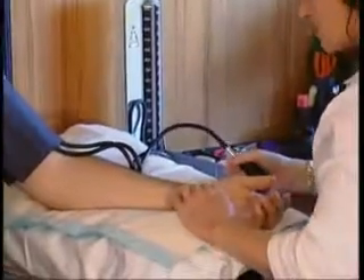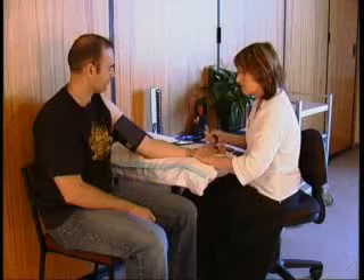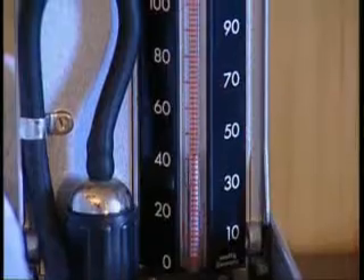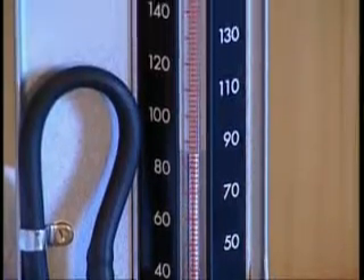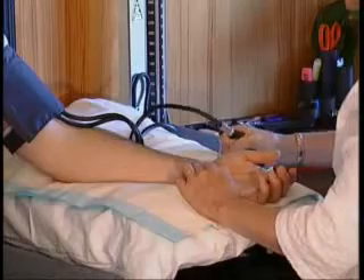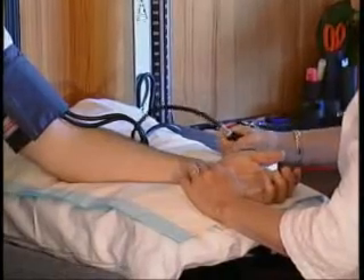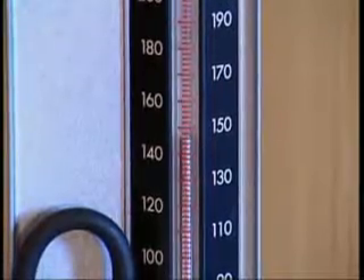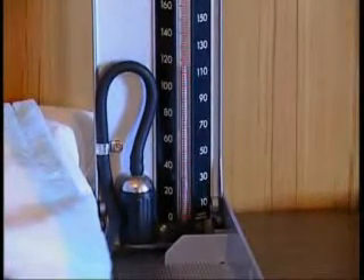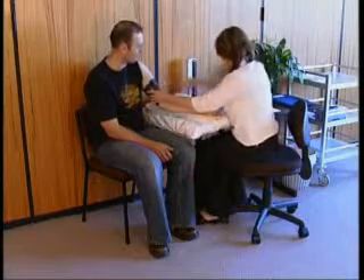Determine baseline. Now palpate the radial artery. Close the pressure valve and inflate the cuff, noting the point at which the pulse is obliterated, and continuing for another 20 to 30 millimetres of mercury to avoid missing an auscultatory gap. Release the pressure valve to deflate the cuff quickly and completely, and wait 15 seconds.